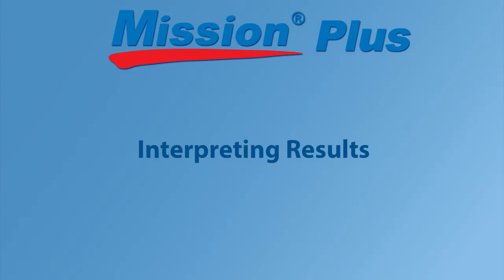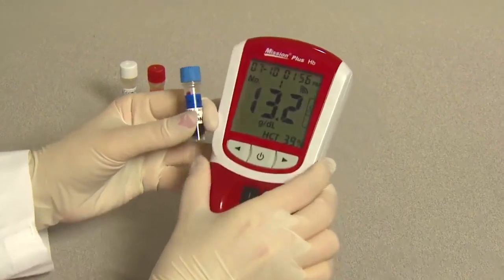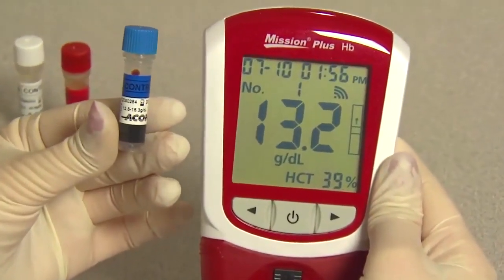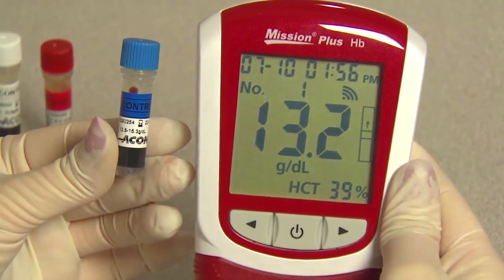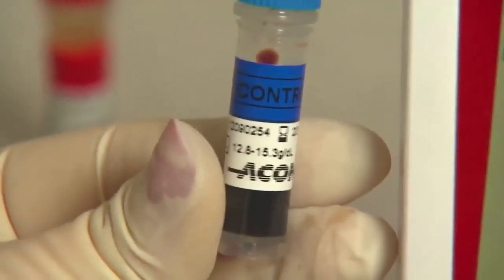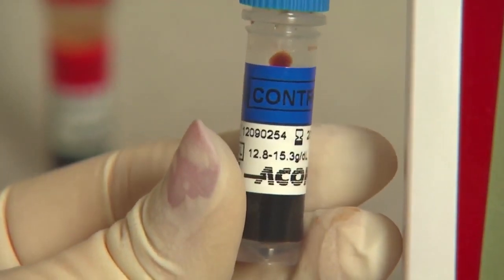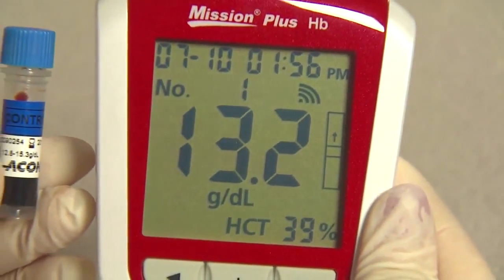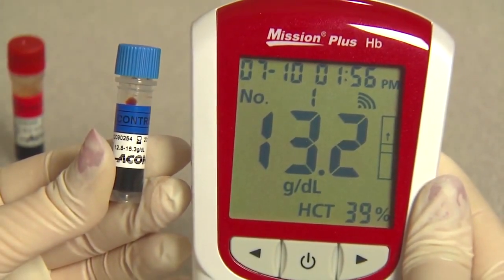Interpreting results. If the result is within the range printed on the Mission HB hemoglobin control solution bottle label, the meter and test device or strip are performing properly. If the test value is outside of the range printed on the control solution bottle label, or if the meter is displaying an error message, see the control solution package insert for further instructions. Please contact your local distributor for additional information.